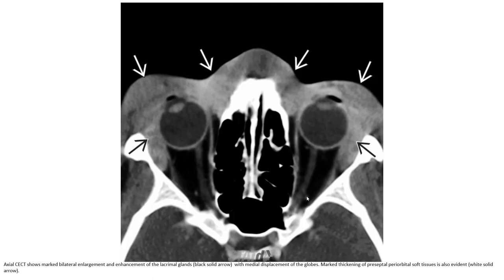This is the Axial Contrast Enhanced CT showing marked bilateral enlargement and enhancement of the lacrimal glands with medial displacement of the globe. Marked thickening of the pre-septal periorbital soft tissues is also evident.